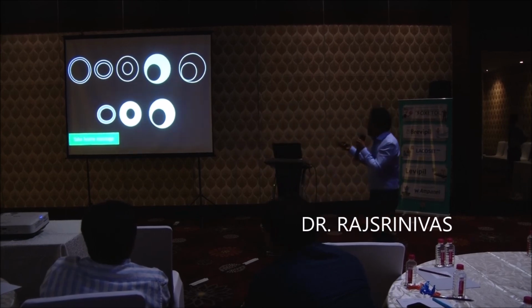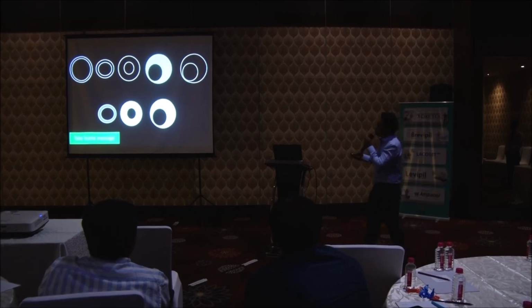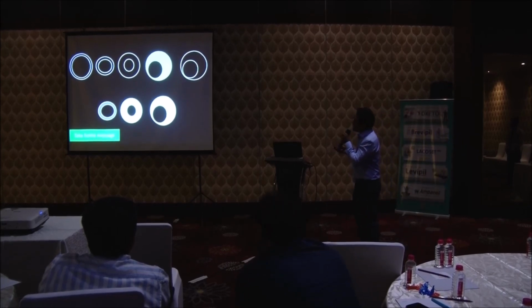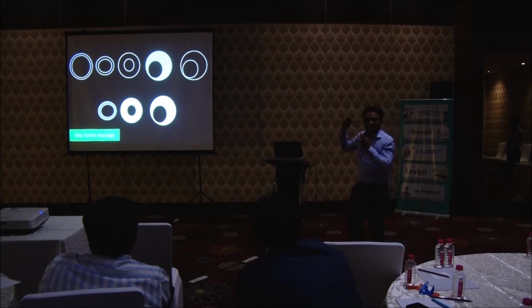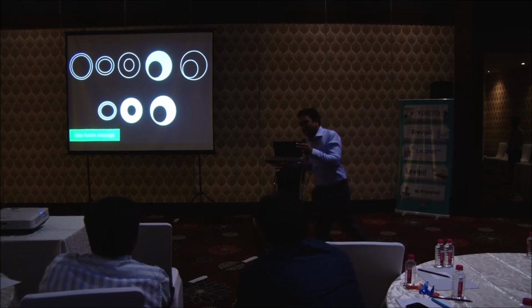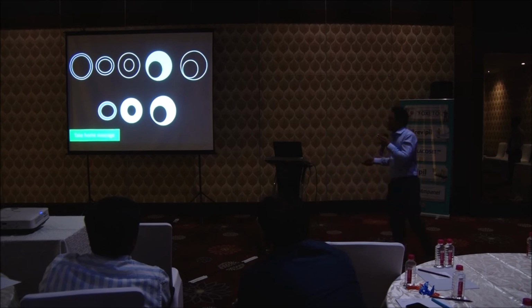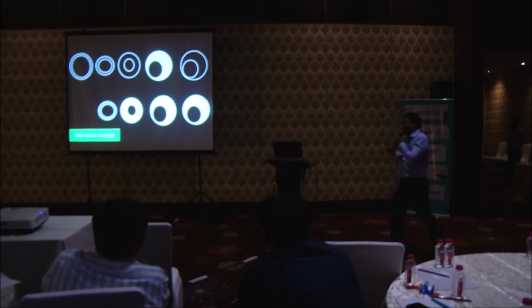Fantastic. This one, tough one. So what is here? If you see here on T1, there is increase in the diameter of the artery, it is eccentric, and there is some T1 hyperintensity. Fantastic, dissection. So this is potentially a dissected artery where there is expansion of the artery and asymmetric thickening of the wall, and this potentially could be dissection. And this one, atherosclerosis. Fantastic, thank you very much.